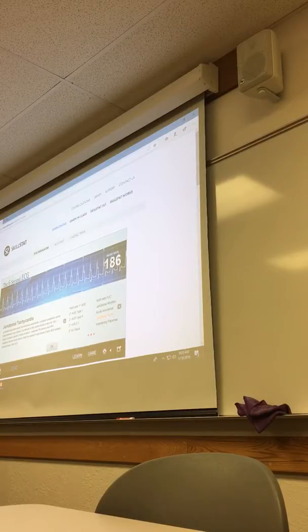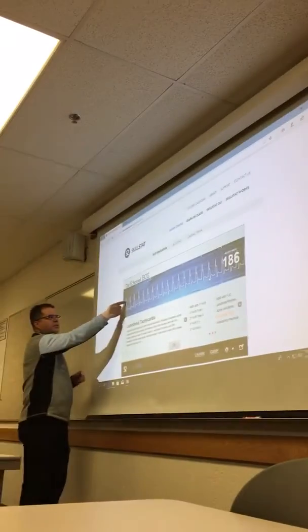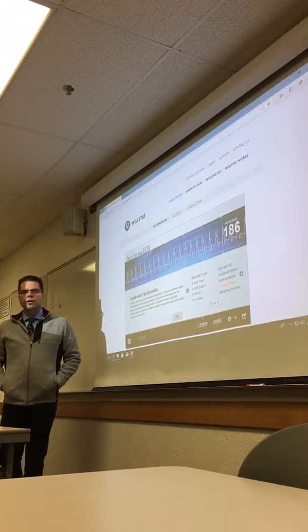And we're not going to go over it. I used to understand it, but it's a little tricky. But if it's on this side, it might be on the other side. So they can tell what part of the branch is broken by looking at the EKG signature. But all that means, when you have these bundle branch blocks, is that it automatically throws your QRS out. Because normally if it wasn't there, it would come straight down and it would be a narrow QRS.